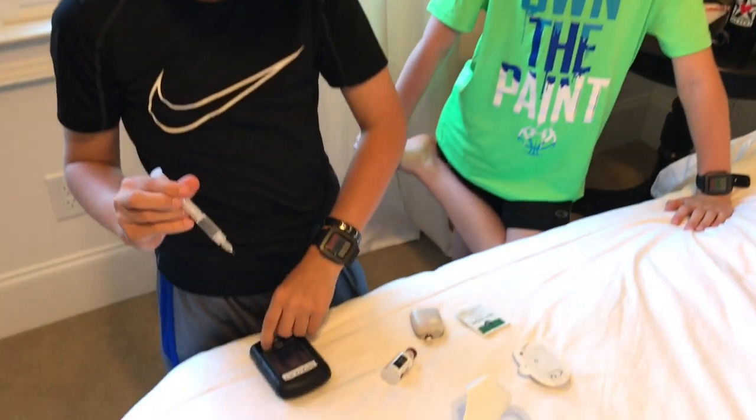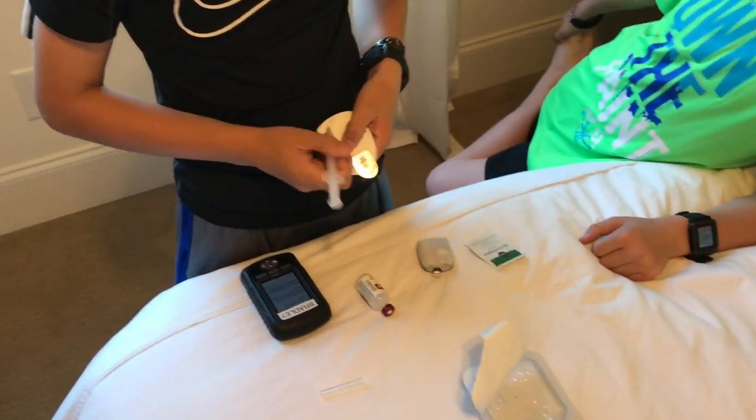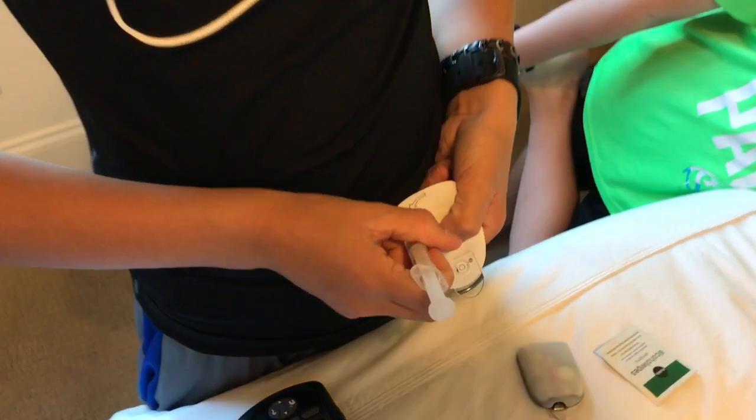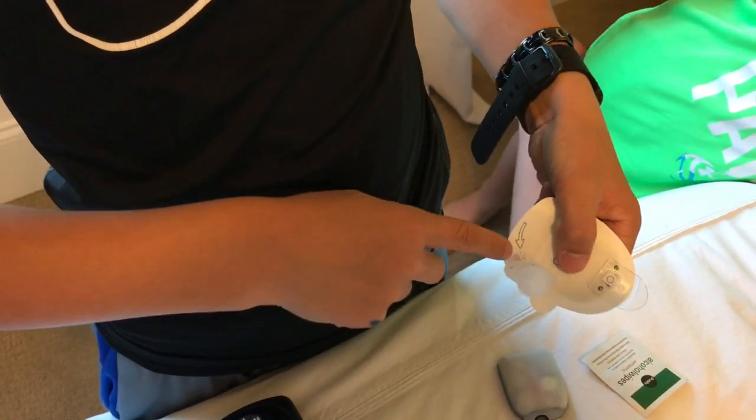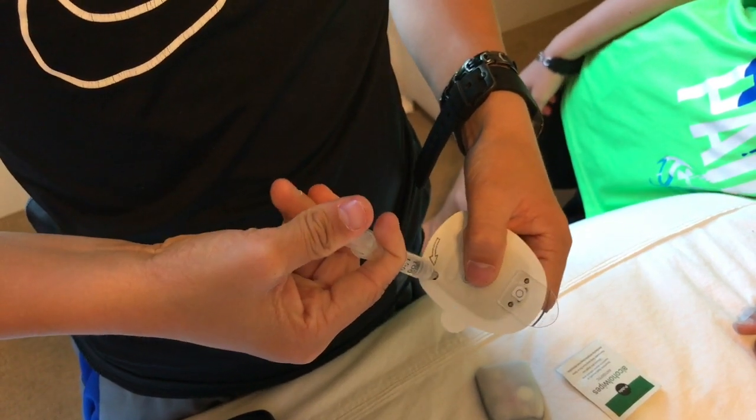Now that there's a good amount of air out, take the new pod and put it right there — the needle goes right in the middle of that soft part. Then push all of the insulin in.